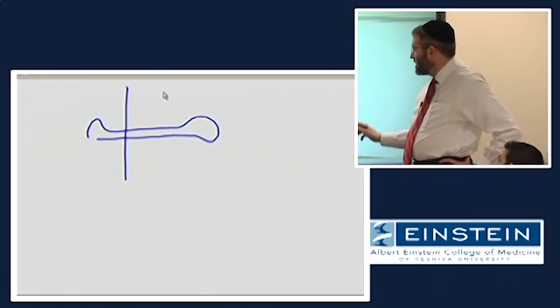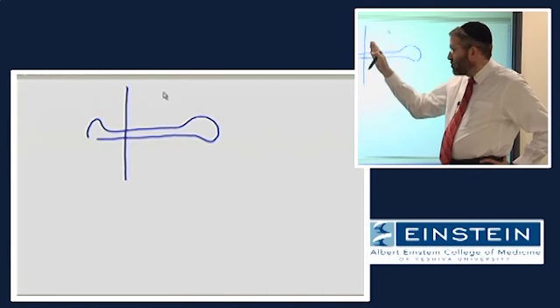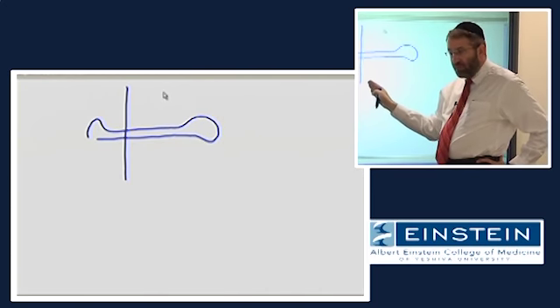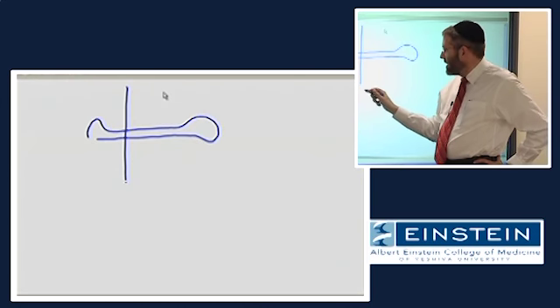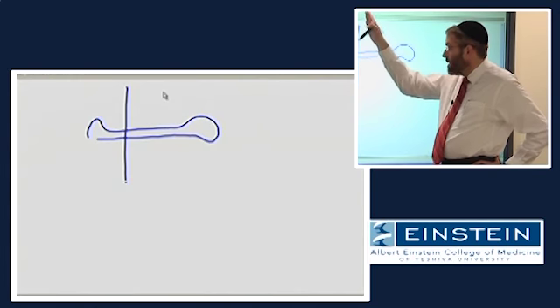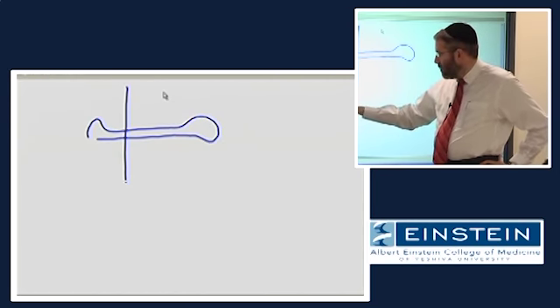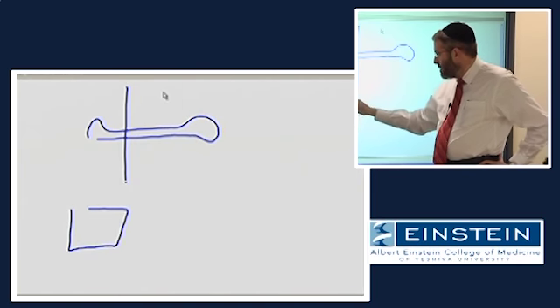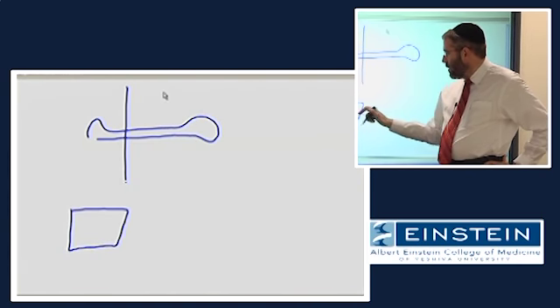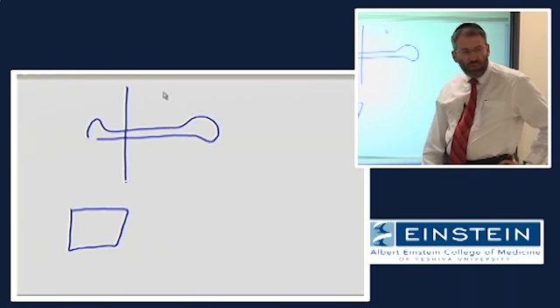Turn on our slice select gradient in the z direction and transmit the correct range of frequencies with our RF to select this location. We now have information that is coming from an entire slice. Yet when we look at that slice, we have no idea where in the slice individual components of that signal might come from.